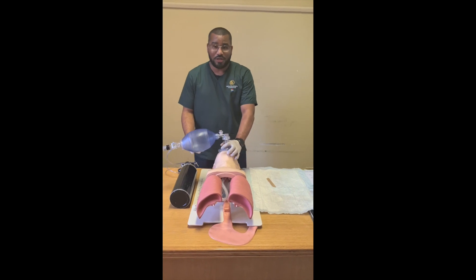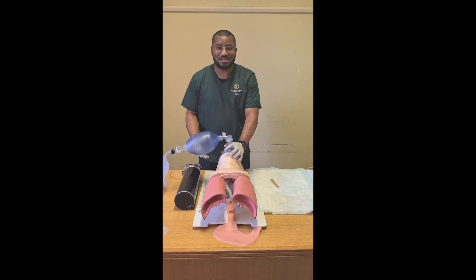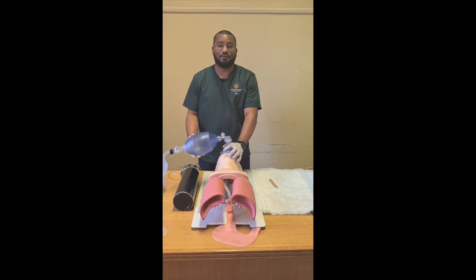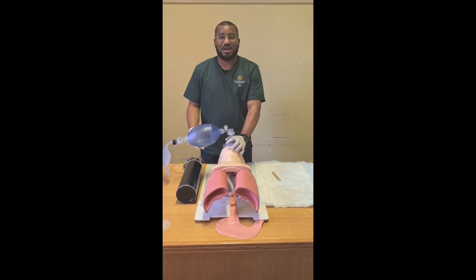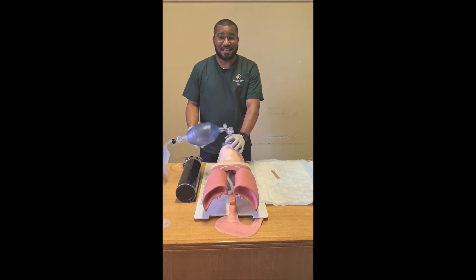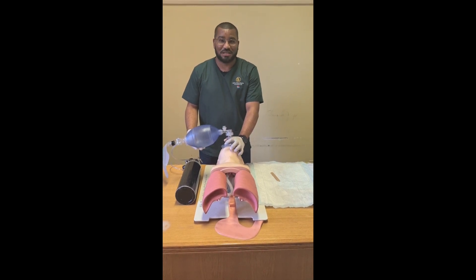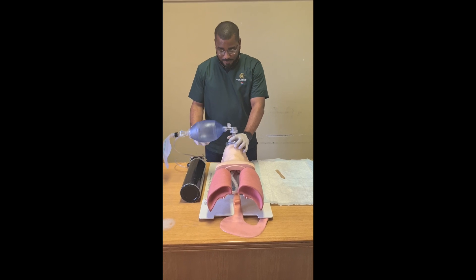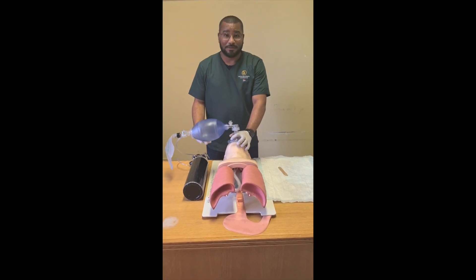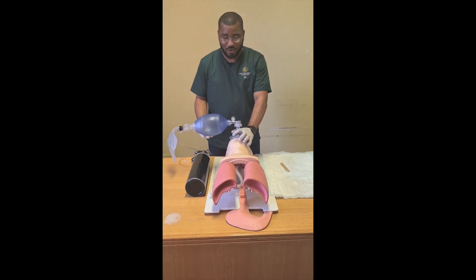From there on, I will continue by giving effective ventilations at a rate of one breath every five to six seconds, with each ventilation lasting approximately one second, and obviously observing for chest rise. Chest rise is a clear indication that air is being delivered effectively. Demonstrated accordingly: 2001, 2002, 2003, 2004, 2005, 2006.